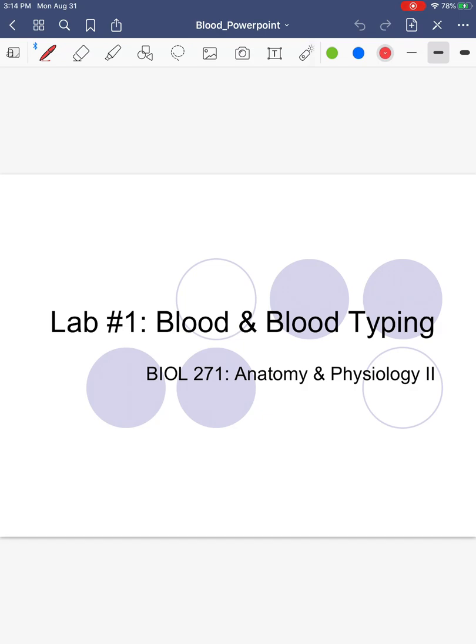I wanted to give a little bit of an introduction to the blood lab. There's a second video where I review blood typing, but for this first video I just wanted to give a really quick review of how to identify the different types of blood cells.